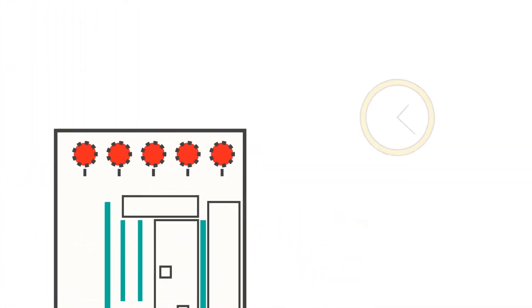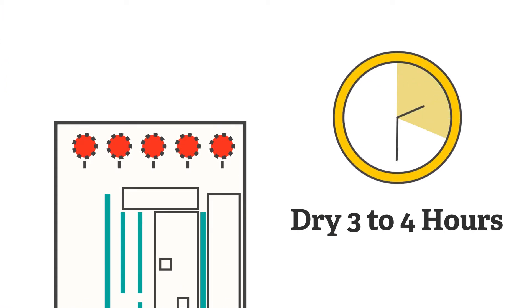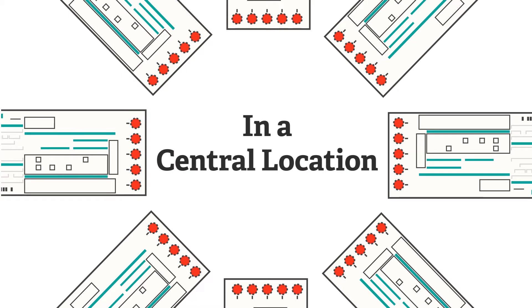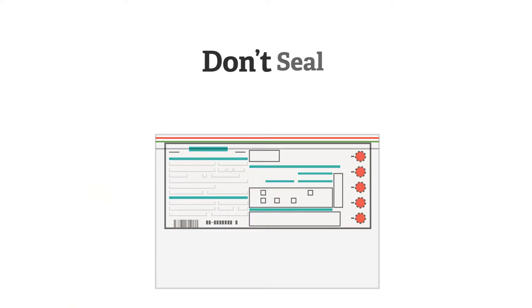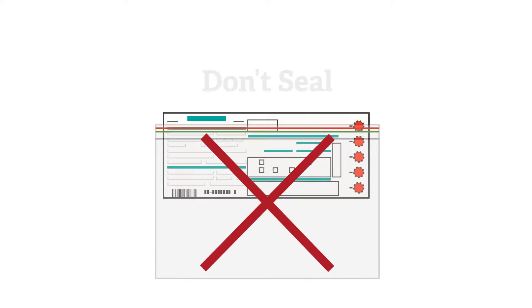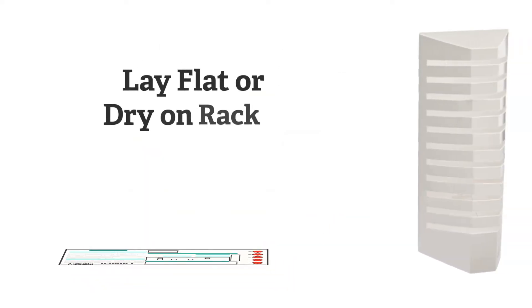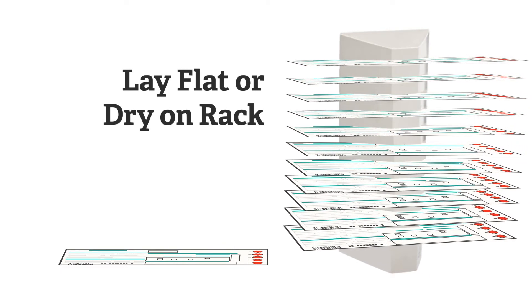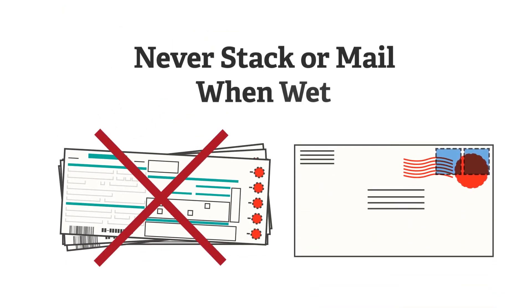Once a specimen is collected, allow it to dry for three to four hours. Dry specimens in one central location so they aren't forgotten or misplaced. Don't put wet specimens in a sealed bag or container to transfer them to the drying location. Lay specimens flat to dry on a non-absorbent surface or in a specially designed drying rack. Specimens should never be stacked or mailed when wet.